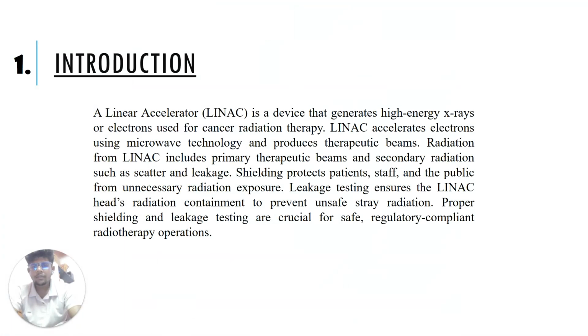Introduction. A linear accelerator (LINAC) is a device that generates high energy X-rays or electrons used for cancer radiation therapy. LINAC accelerates the electrons using microwave technology and produces the therapeutic beams. Radiation from the LINAC includes the primary therapeutic beams and the secondary radiation such as the scatter and the leakage. Shielding protects the patient, staff, and the public from unnecessary radiation exposure.